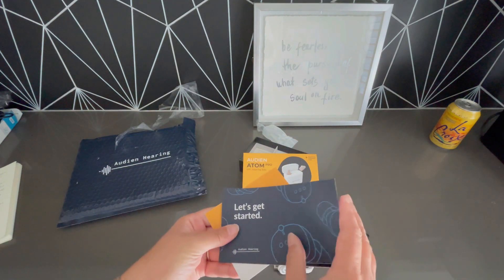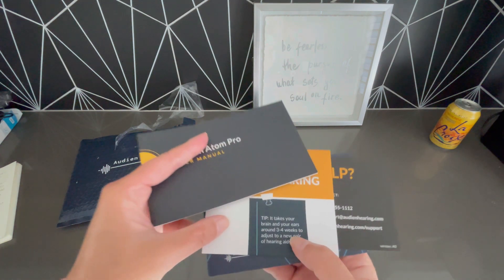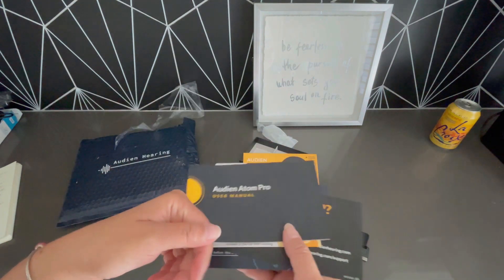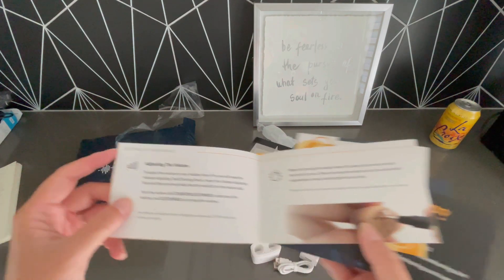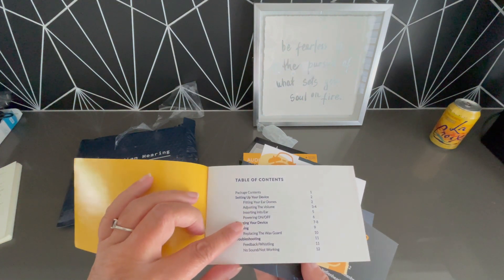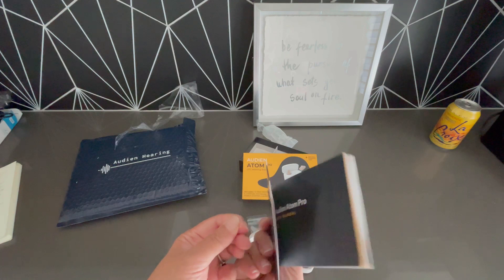So this is all the fun stuff you can expect to see in your box. There are some guides here. It says it takes three to four weeks to adjust, which is good to know. It shows you how to adjust the volume in the book — fitting, adjusting the volume, how to put it in your ear, charging, and cleaning. Everything you need to know to operate and maintain the device.